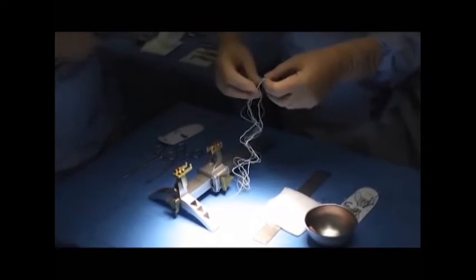Remove the pull-up BTB from the mount sheet and place it on the Grafts table. Wind the traction and flip sutures around the table and secure them with a clamp.